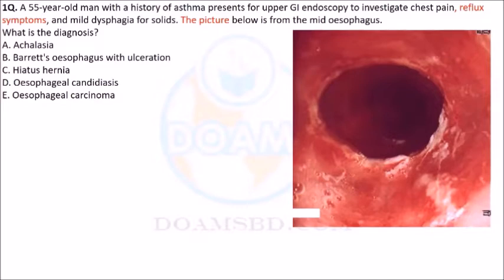We don't expect more secretion or anything from the esophagus. So the multi-layered esophagus cannot show underlying blood vessels too brightly. Clear now? Dr. Rizwan, can you hear? Please be with me. Wherever the epithelium is thick, multi-layered, the color is not red. But in the stomach epithelium, there is a full of glands and many things, blood supplies. So this layer is single layer and the epithelium is red.